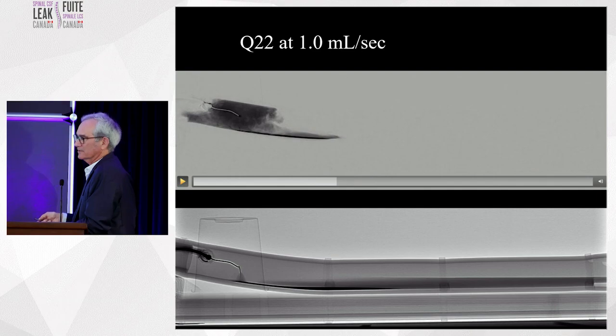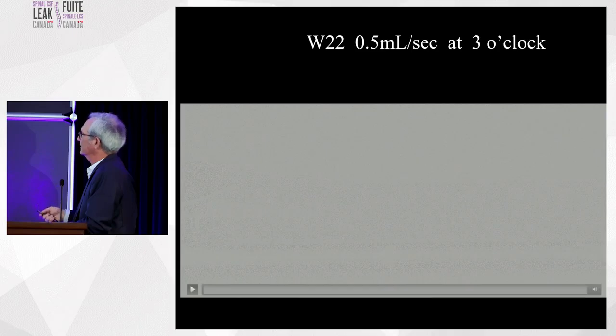So that's the turbulence you're creating. That's the explosion you're creating. There's no way you're going to have a nice, dense, beautiful puddle if that's how you're going to inject your contrast. So it's pretty cool that a little quick experiment can help you figure this out.